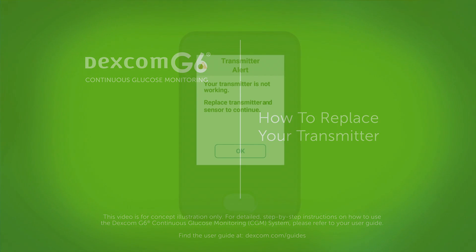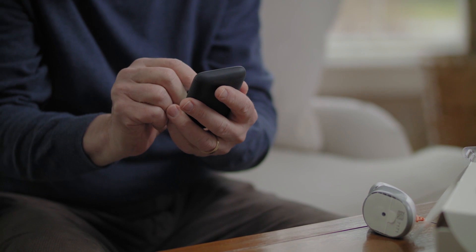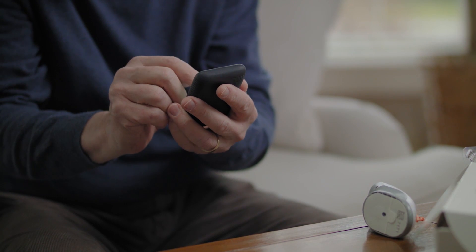Your transmitter battery is good for up to three months. Starting at three weeks before the end of its battery life, the warnings count down the transmitter battery life until it has only 10 days, one sensor session left. If the transmitter battery has 10 days or less remaining, you won't be able to start a new session.